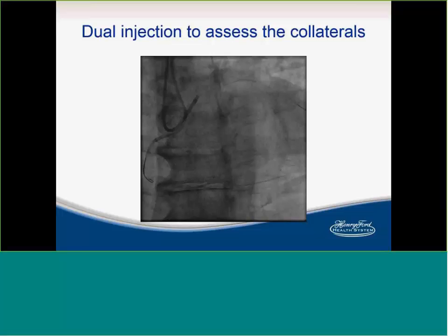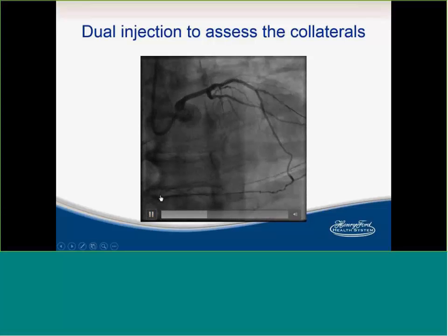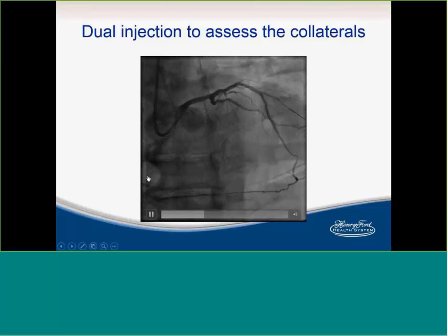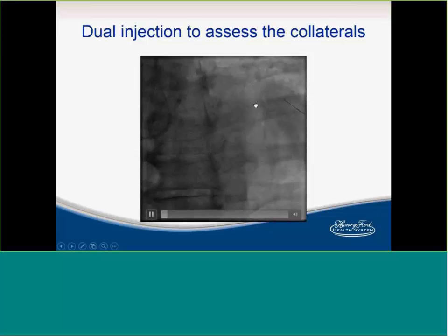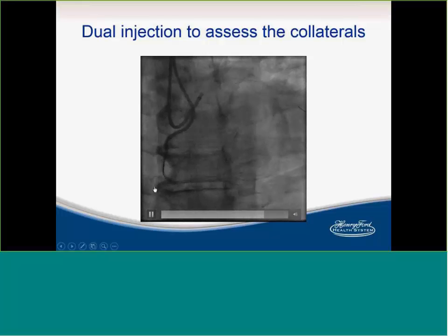So pretty much this is the dual injection. We injected antegradely a little bit late, but if you notice here, guys, there is a complete segment of occlusion in here. So now the decision is, and if you notice, I'm already inside that stent in here, and I have a Corsair microcatheter, and this is probably my run-through. This is my workhorse wire. It's just a run-through wire, and this is another run-through wire. So I'm trying to decide how I would go with this.